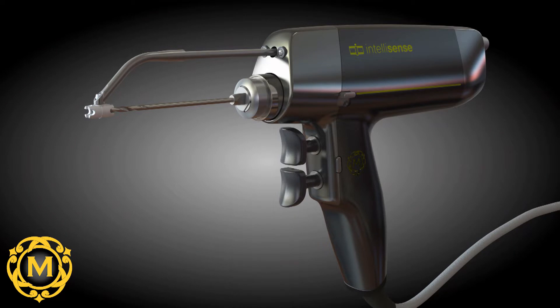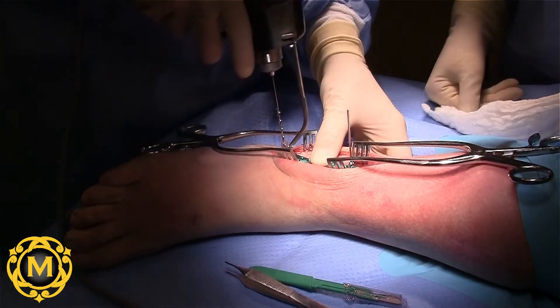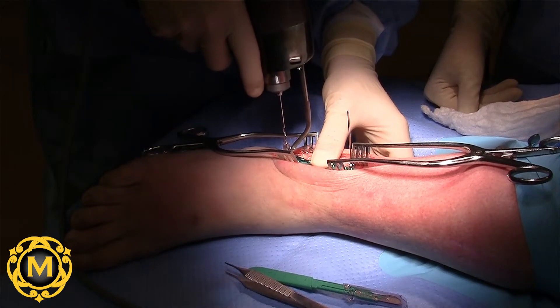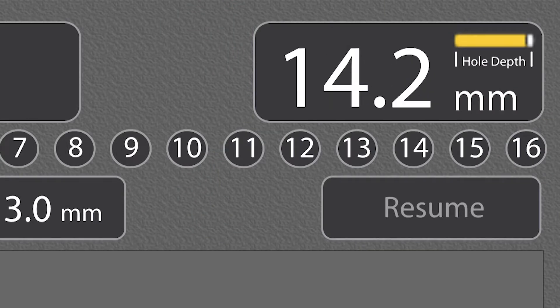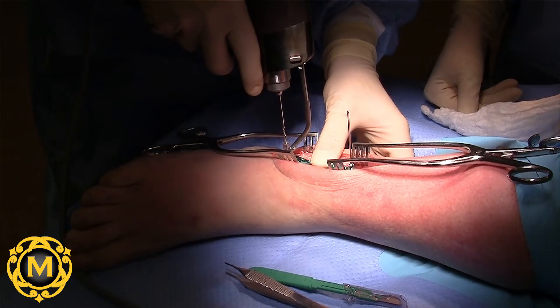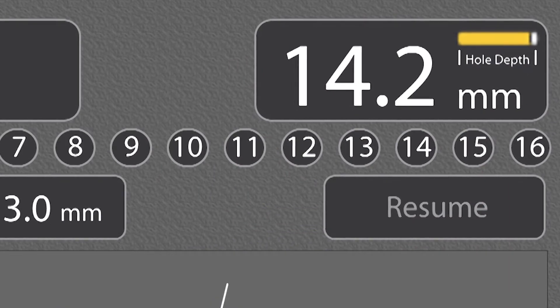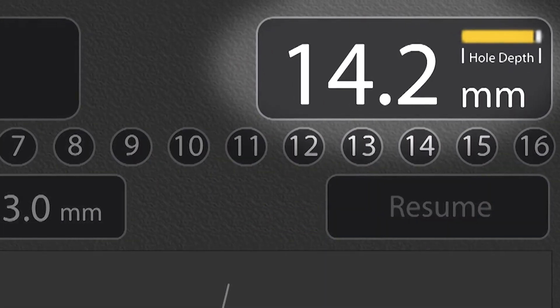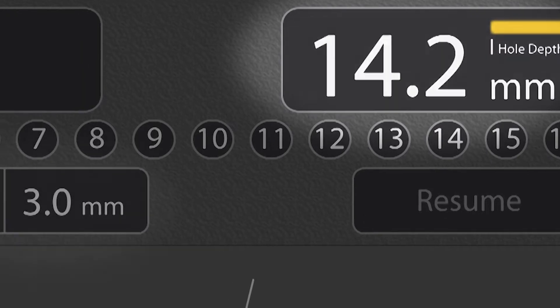Like other surgical drills, the bottom trigger is for forward motion and the top trigger for reverse. Using the IntelliSense drill with its standard sensing technology attachments, the first hole was drilled in the distal portion of the lateral fibula plate. IntelliSense's proprietary sensing technology measures hole depth as it drills, and this measurement correlates with a precise screw length measurement. An audible signal is heard at each cortex and a real-time display of the drill depth measurement is shown on the controller. The IntelliSense drill is powered by its controller, and the drill depth measurement can be seen on the controller display.